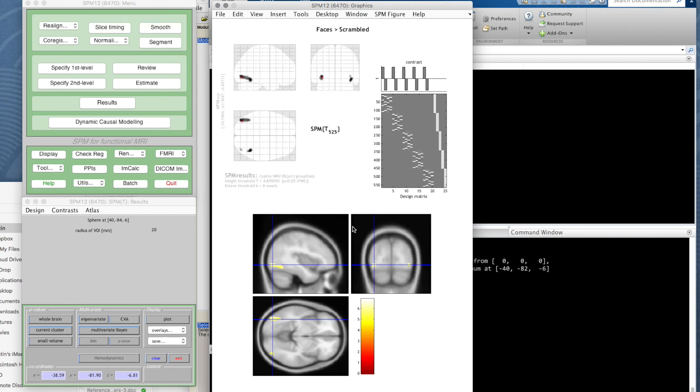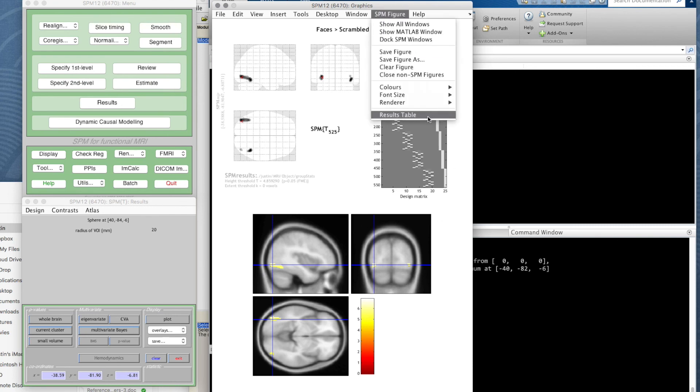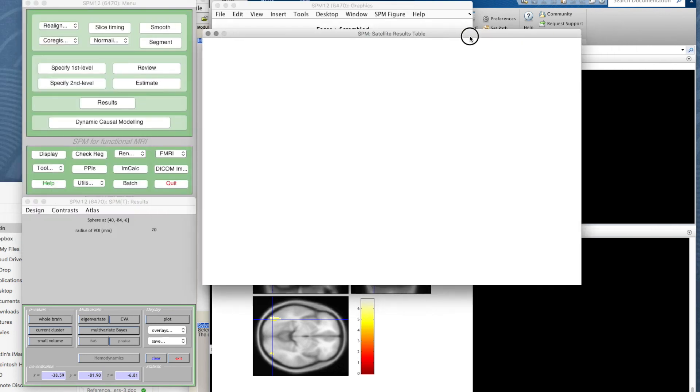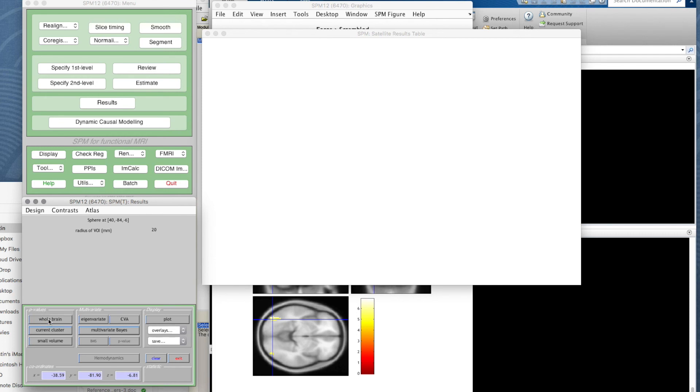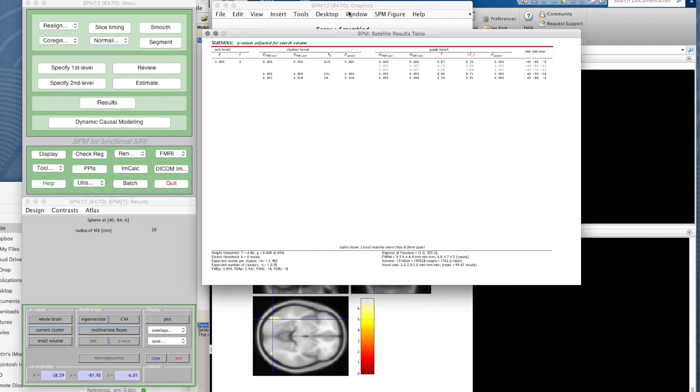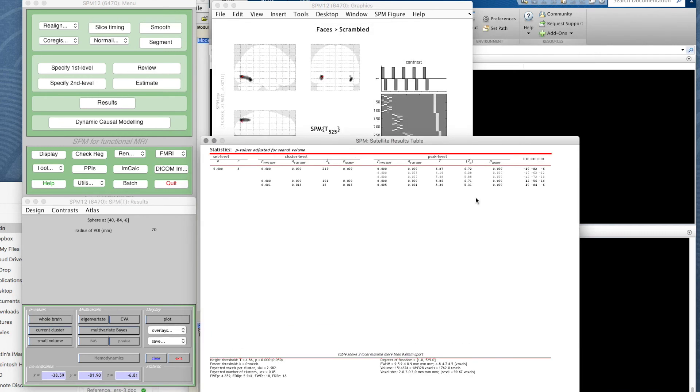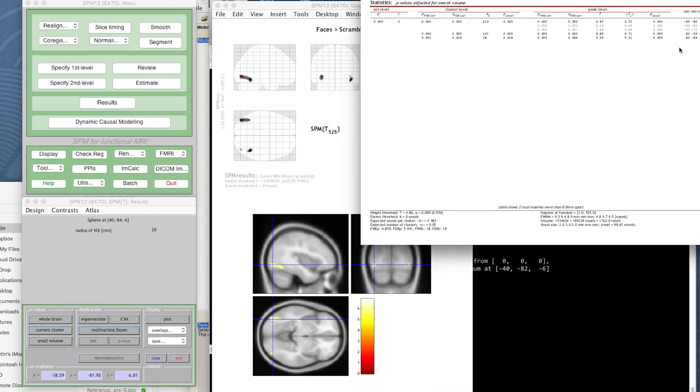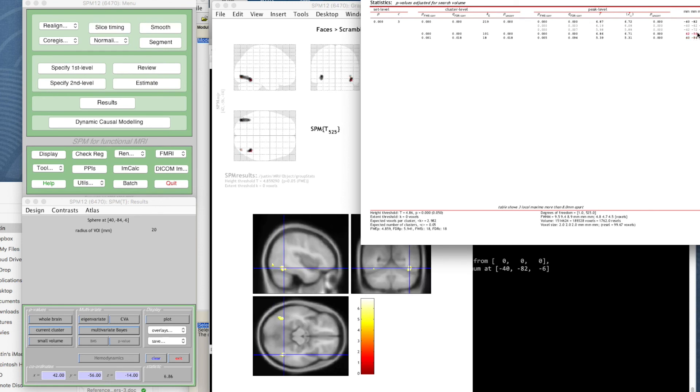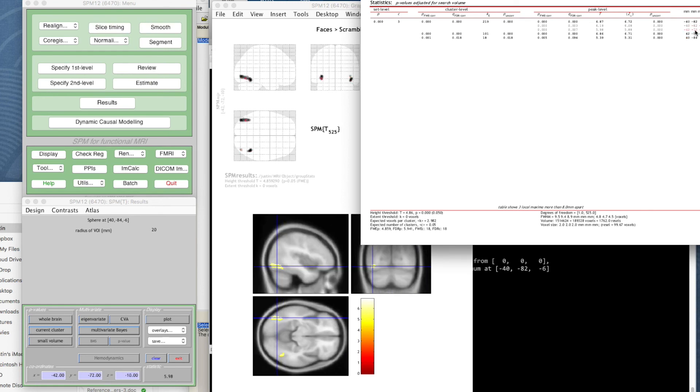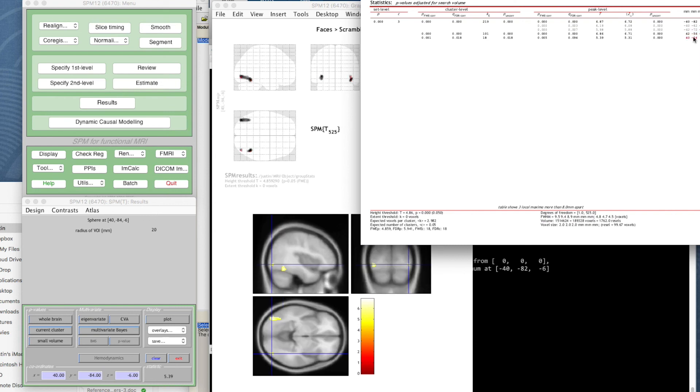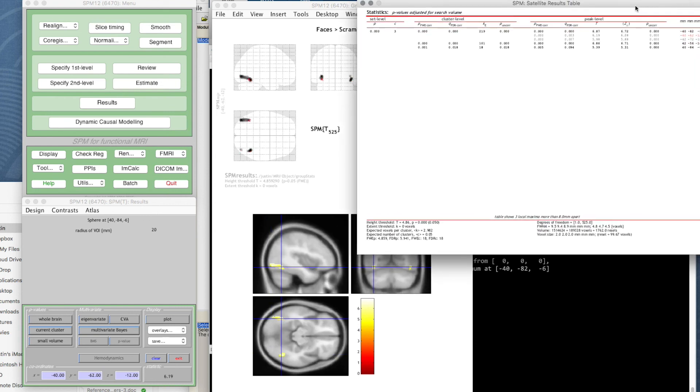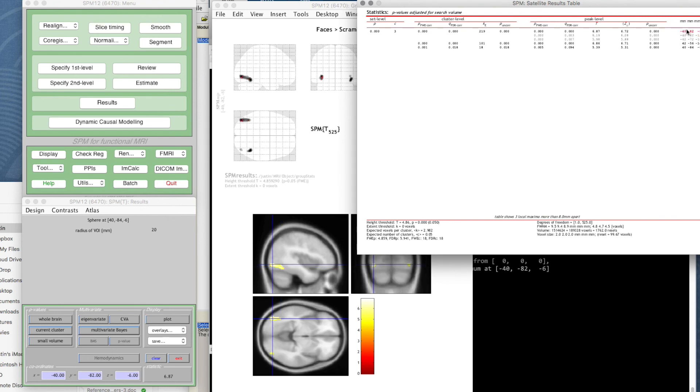Also, now that we've got our overlays up, that little table of data has disappeared. It's nice sometimes to be able to see that as well. What you can do is go to SPM figure, click on results table—we get an empty figure for now—but if we just go to this panel and under p-values click on whole brain, it's giving us the summary results for the whole brain. I could click on one of these and all the figures jump about to highlight these locations.